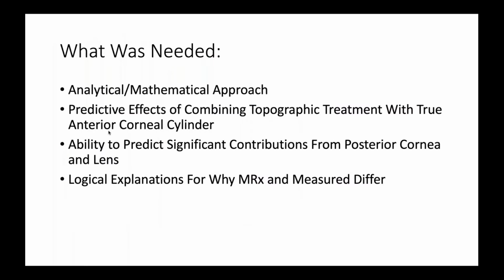And I decided that what was needed is simply to stop guessing. We had Alcon guess at the beginning that Contoura topographic guided LASIK, that we should treat off the manifest refraction. And it was a good guess because that's the way we had always done LASIK. It's what we do for wavefront optimized. But at the end of the day, it was a guess. And then the pendulum swung completely the other way and we said, you know what, we should treat off the full measured anterior corneal astigmatism, TMR. But that was a guess as well.